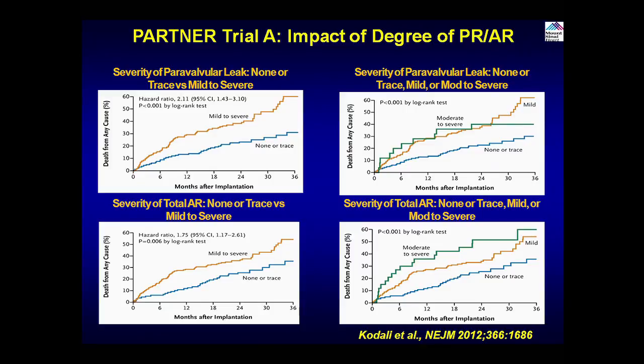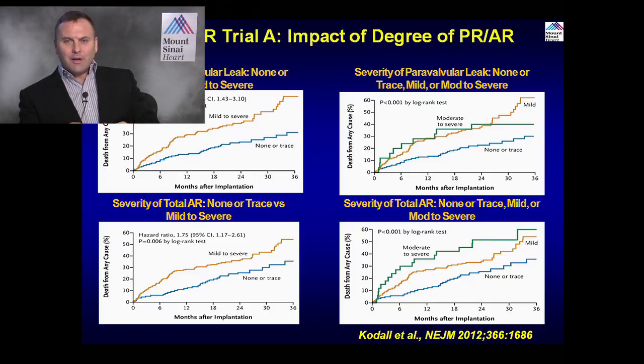We generally don't see any paravalvular leak in open heart surgery; if we have a little on an echo afterwards, we generally go back on and fix it. In the absence of hemolysis, a trace paravalvular leak shouldn't have much of an impact on loading the ventricle. Having said that, patients with AS generally don't have much AI, so we're changing their pathology a little bit, mild.